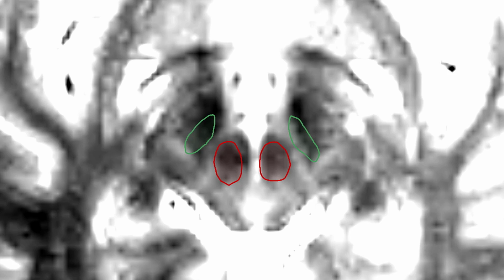Ideally, an experienced person will correct the model according to the reality seen on MRI when planning the target during surgery or later. However, I suspect that often this will not be the case and that the programmer will simply accept the model from the navigation system as representing the reality. But this is perhaps not a major problem. Most often the model is good enough, and at least in the cases that I myself have seen with more significant deviations, this would still not have any major impact on how we plan the VTA.